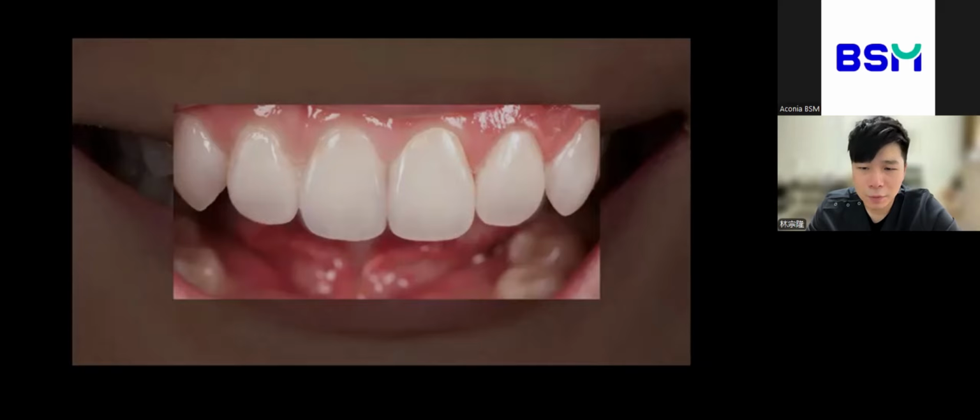This becomes really important when we are dealing with incisal translucency in anterior veneers. Because of this built-in gradient, you don't have to spend too much time on complex porcelain layering. Even with simple stain, the result can look very good for most patients.